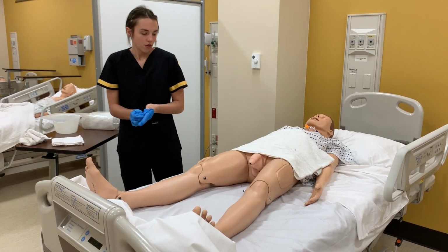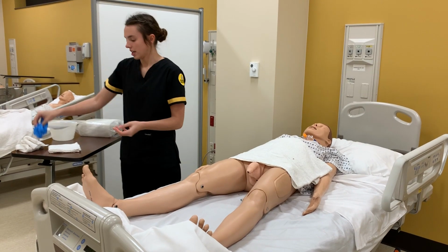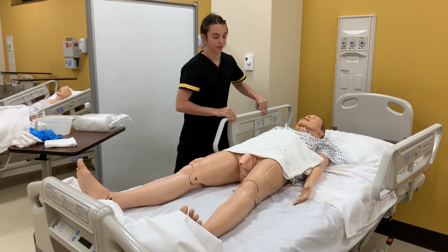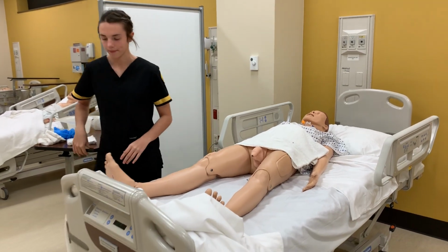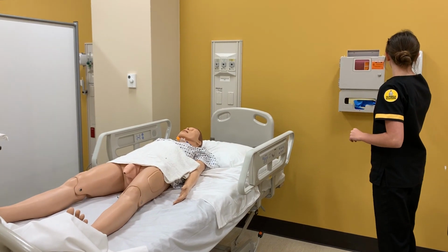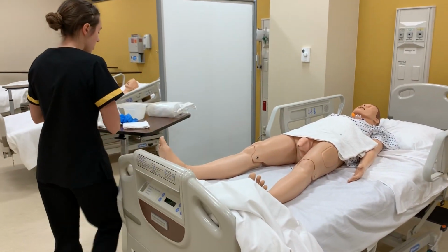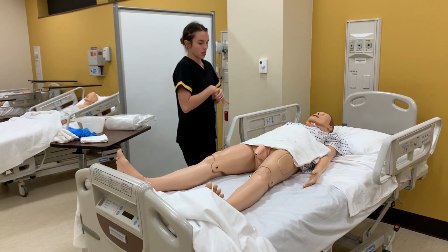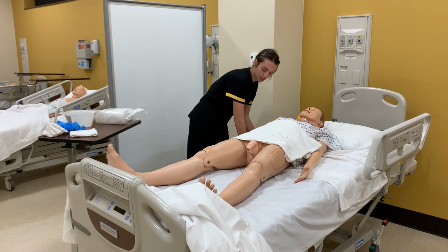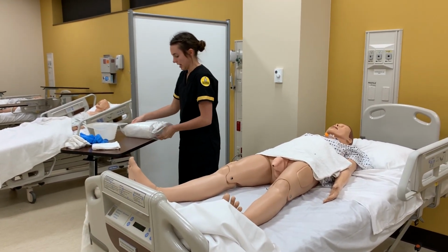So now we are going to start with our sterile part. So I'm going to go get some more Germex. I'm going to put your bed roll up for 2 seconds since I'm walking away. And here we go. So we shouldn't have much discomfort with this procedure, but if you do, just let me know and we will get anything situated.